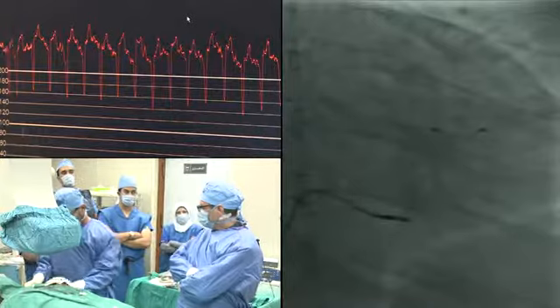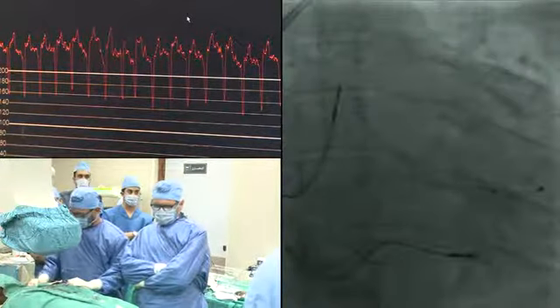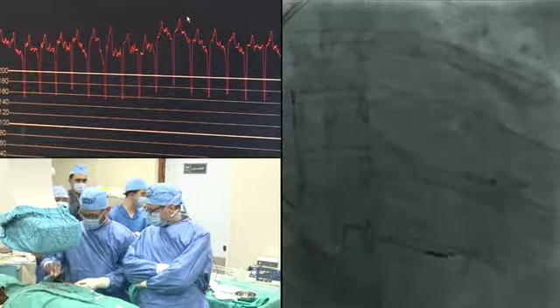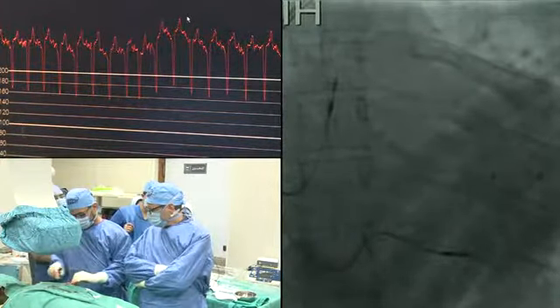I just slit actually. I don't look at the fluoro. This is a little bit brave. You know, if it's going to move, it's usually going to move. It's actually very rare to dislodge a lead with slitting.